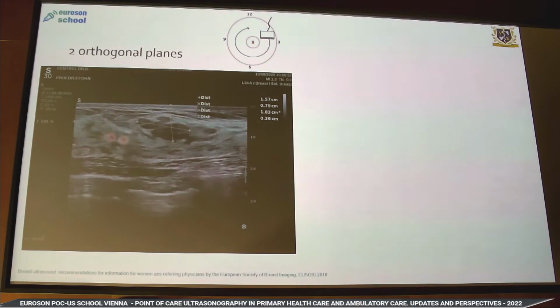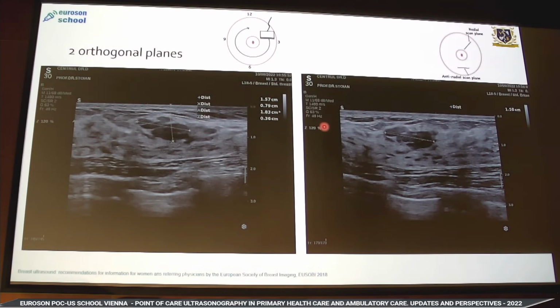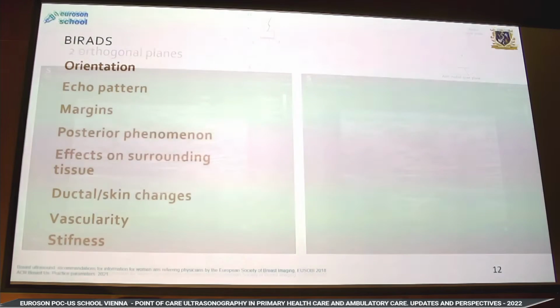Once I see the lesion, in a typical TDLU position that Professor Rami explained yesterday, I always rotate the probe by 90 degrees, and I immediately have the third dimension. So I have the 2-dimensional position relative to the nipple and the skin, I rotate, take the third dimension, and I know where I'm standing and that this is a real lesion.